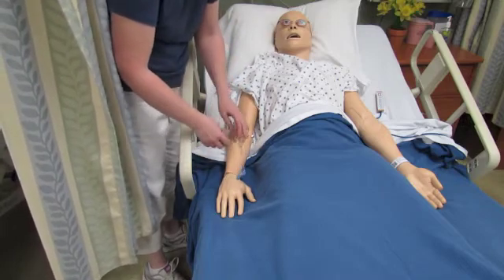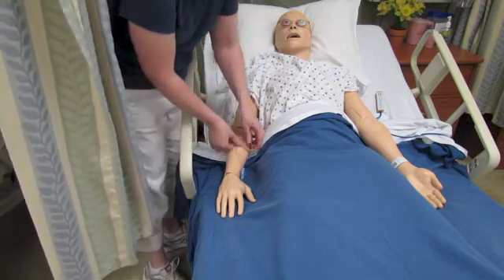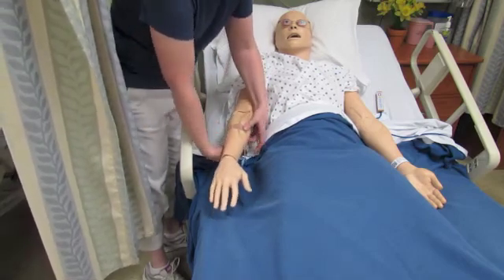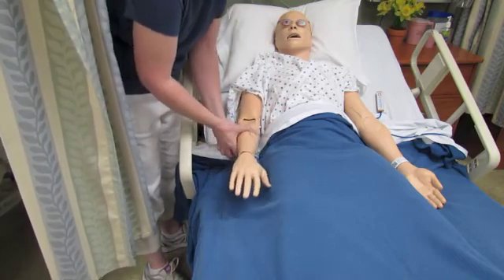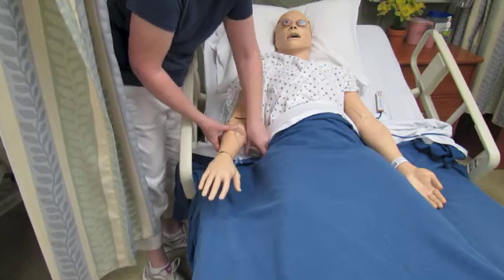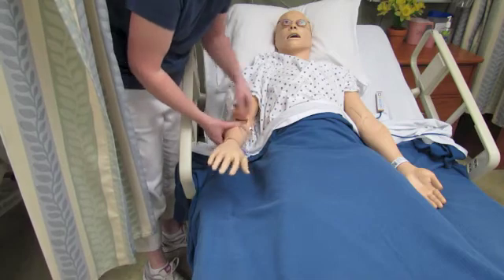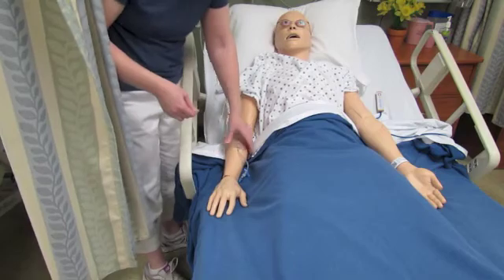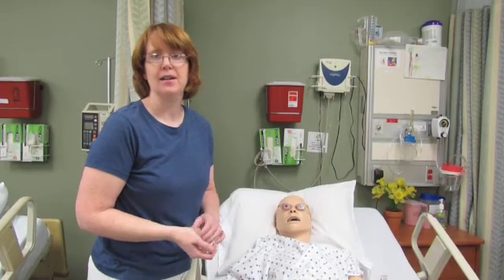And then you find an appropriate site where you would have inserted your needle, and then just take the Coban and wrap it around the patient's arm, covering up what we like to call our golden connectors, even though they're plastic. To us, they're like gold. And again, I will give you the website where you can acquire some of those very inexpensively. And that's how we like to avoid using our mannequin veins that are in their arms.